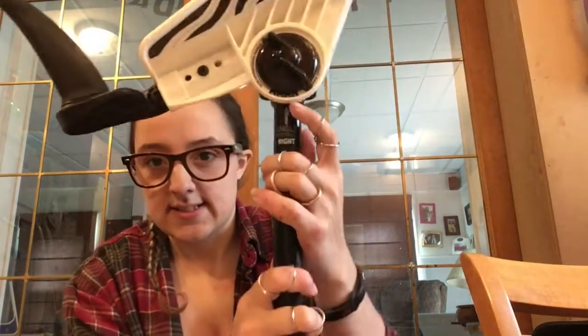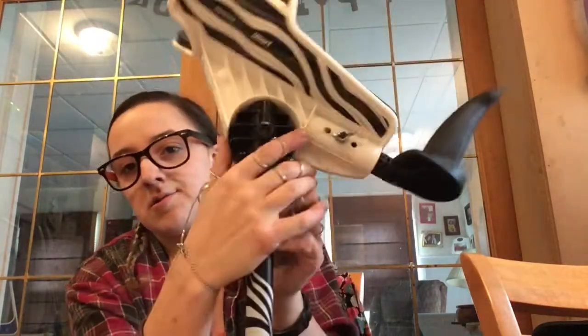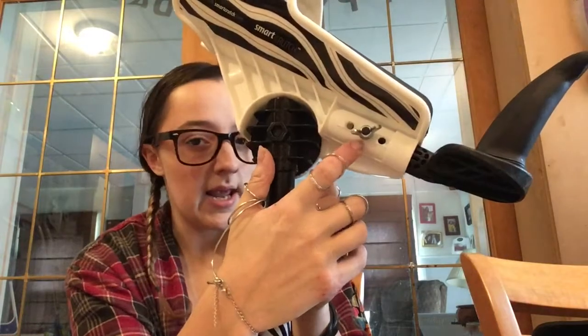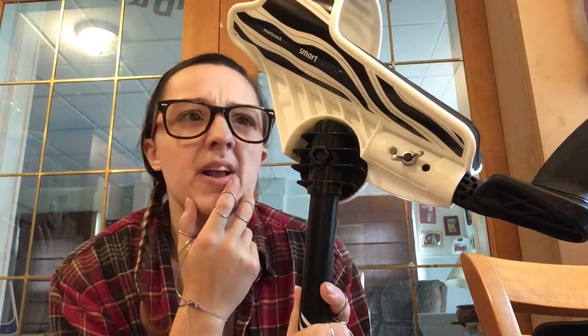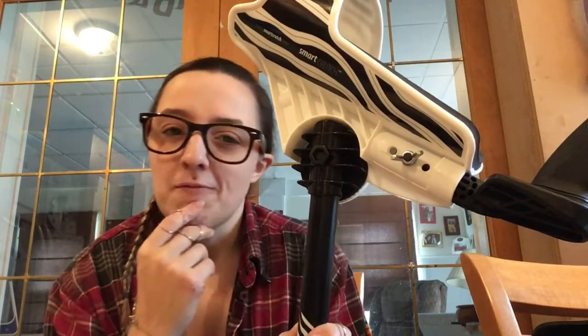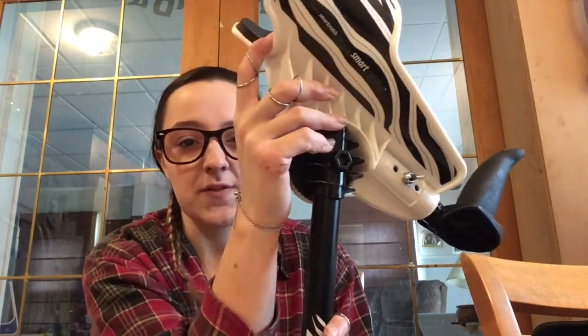Whoop. All right, so that took a little longer than I wanted it to, but I basically figured out that I think I like my settings. This one at 6 and this one on the second setting. And so I set up both the crutches like that, and they seem to be pretty comfortable. I'm just not sure. It's hard for me to measure my own elbow and see if it's 1 inch away from the end of the crutch over here. But I'm going to wait till somebody's home, Brandon's home, and we're going to figure out how that works.